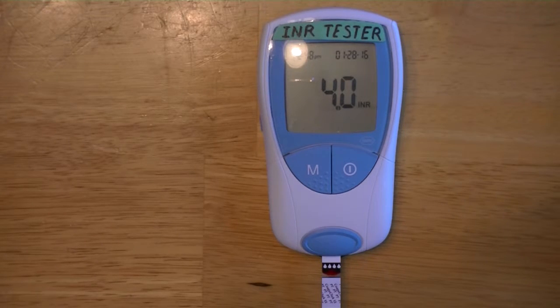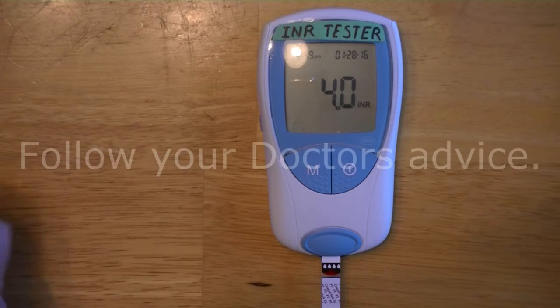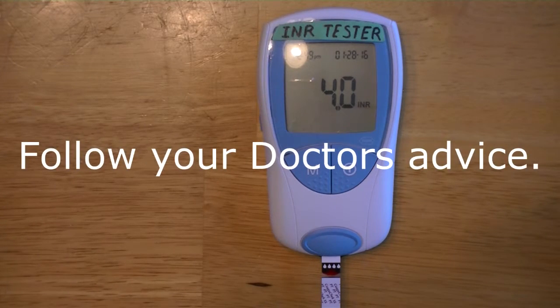Mine's a little high today — four is the absolute top of my range. The doctor is going to call me in the morning and tell me to adjust my warfarin levels, so he'll probably drop my dosage on a couple of days for next week.